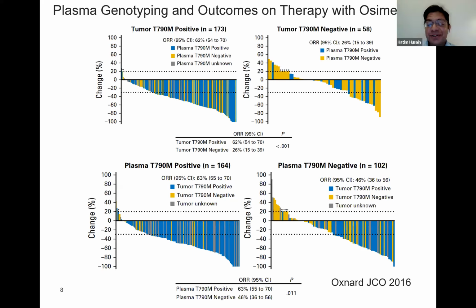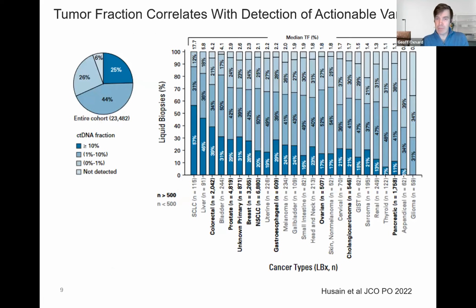Yeah. No, I think it was super interesting. And for me, particularly when I saw these figures, one thing that resonated with me, specifically in this figure on the bottom right, is that if you do have a plasma negative test, you can't not do the tissue. And I remember you had a schematic in this paper, a flow diagram, where you looked at that. And that's what led to the label of liquid biopsies, saying all the labels say, FDA approval, after a negative, check with tissue, right?